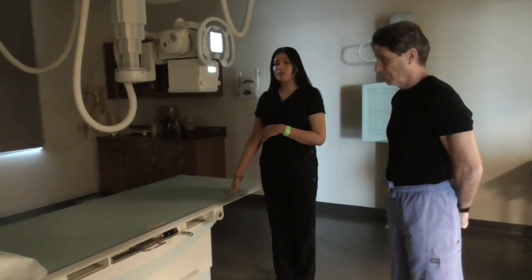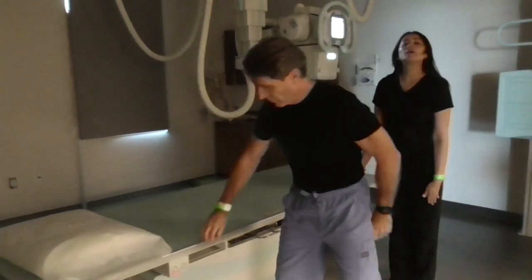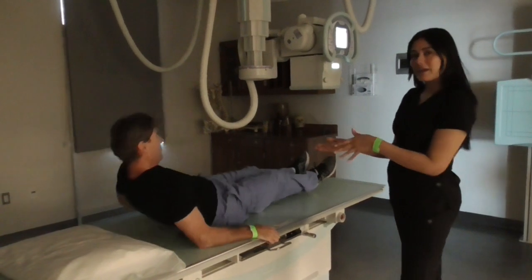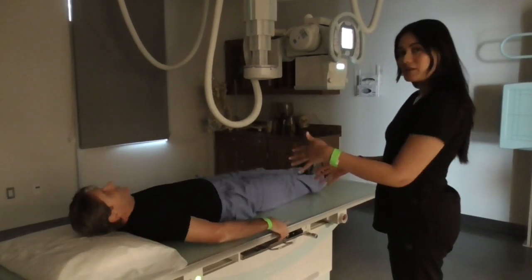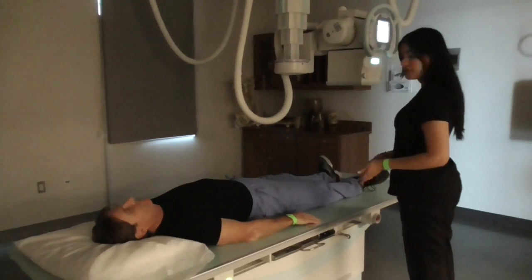I'm going to have him lay on the table supine, face up. Go ahead and lay on the table. We're going to be using a 14 by 17 — in this case we're going to be doing it crosswise because he is a male. So my patient is laying face up.